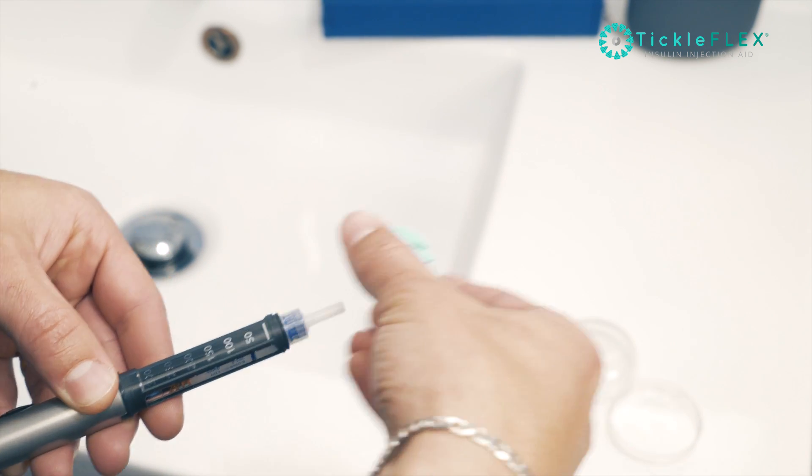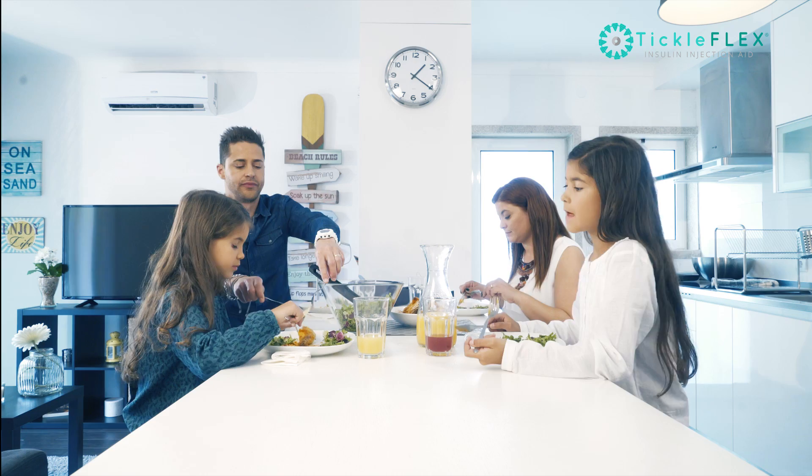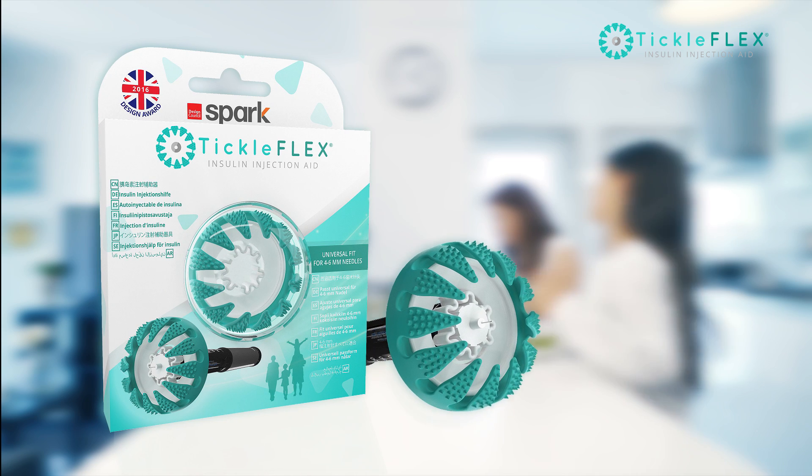Enabling you to better distribute the load on injection sites, and the circular pad prevents you from injecting too deeply. With more control and more confidence, just press and go.